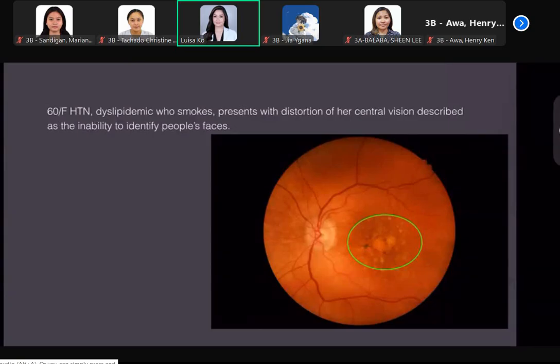Do we see anything in the retinal periphery? No lesion seen on the retinal periphery or along the inferior and superior vascular arcades temporally. But what do we see on the macula? You can just describe, so you can say there are multiple areas of hypo and hyperpigmented lesions. Some people will say it's geographic, it's yellowish lesions. If you don't know the technical terms, it's perfectly okay to describe them.